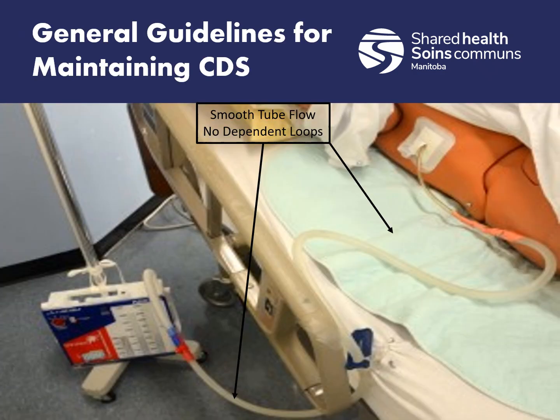With that, we want to make sure that negative pressure is less than what's in the chest. The best practice for safe and effective drainage is to keep it lower, ideally at least 1 foot below the chest insertion site so we can assist gravity for drainage. Okay, so we're going to make sure that we keep it clear. We want to make sure that tubing is straight. As you can see here, there are no kinks, it's not wrapped up in itself. There are no dependent loops, which is really important because that can cause blockages.